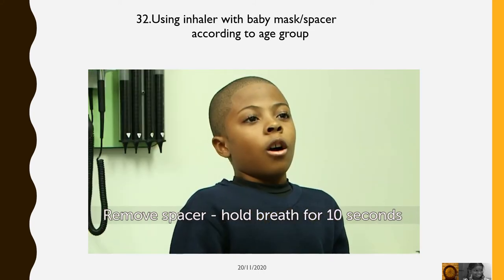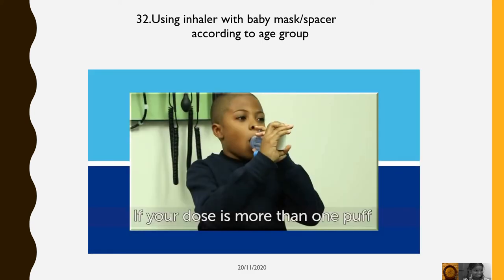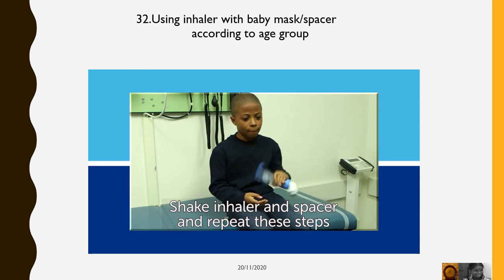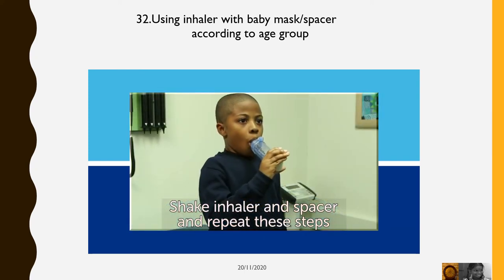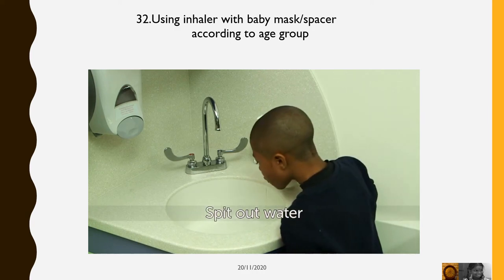Breathe out and then remove the inhaler from the spacer. If your dose is more than one puff, shake the inhaler and repeat these steps. Finally, rinse your mouth with water and spit out the water.